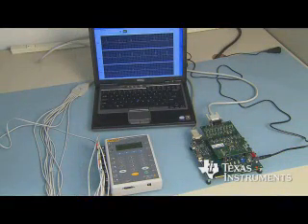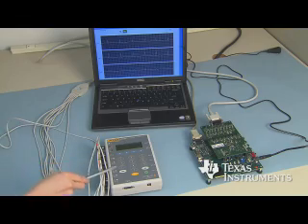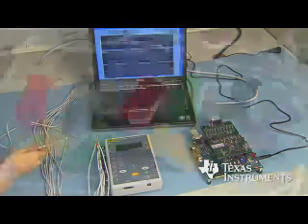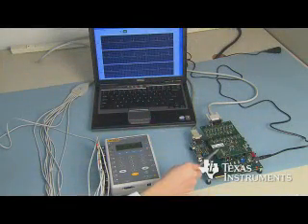In this video we are going to show you the electrocardiogram demo and development kit. The demo setup consists of a multi-parameter signal simulator, an ECG cable with up to 10 electrodes, an ECG analog front-end board, a C5505 evaluation module, and a personal computer.